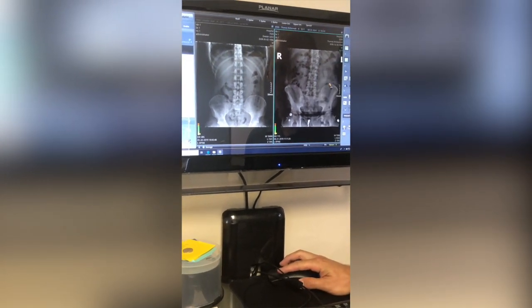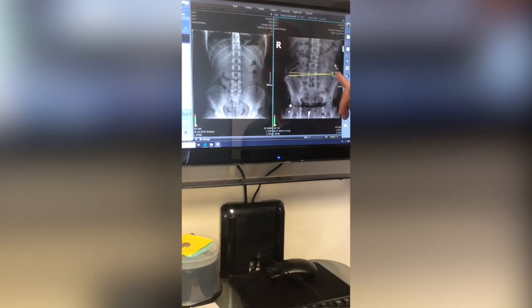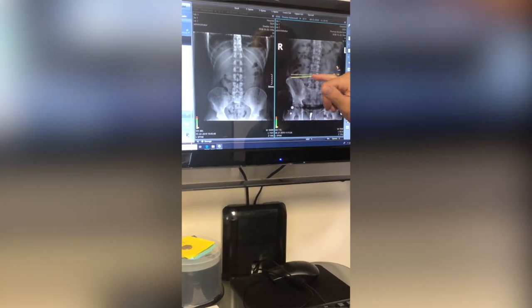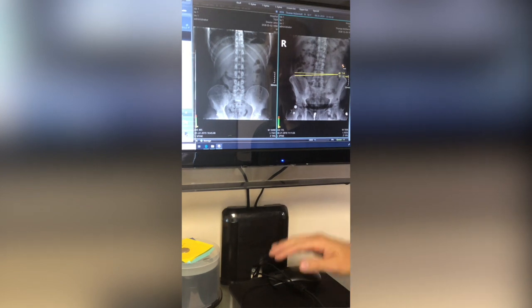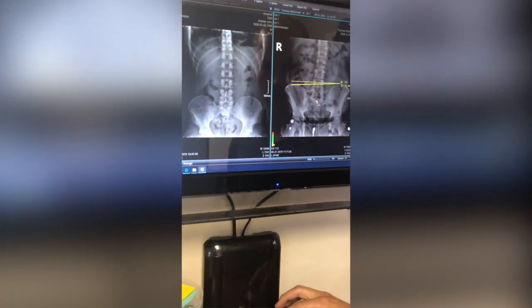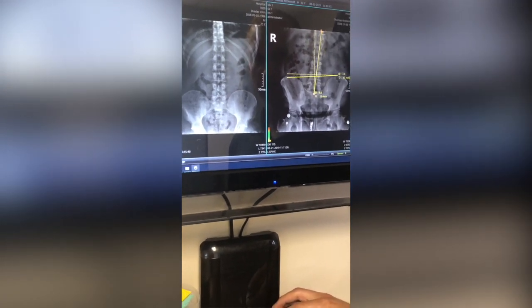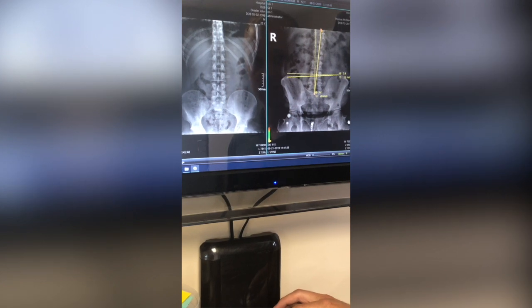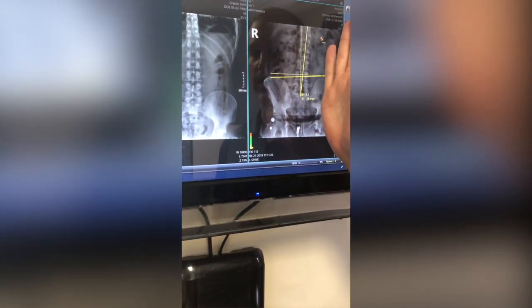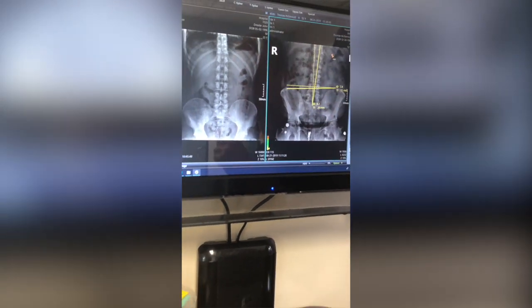So I take a horizontal level. We have that for all our patients. We can see this left hip's higher. That dotted line is perfectly horizontal. The solid line connects the two. So there's a little bit of misalignment there. And then he's a little off center too. So I take a vertical level and go straight up. That dotted line is perfectly vertical from the middle of the sacrum. That solid line is the track that he's on. You can see that he's really shifted off to the side. So he has a pelvic unleveling and his vertebrae are off to the side.